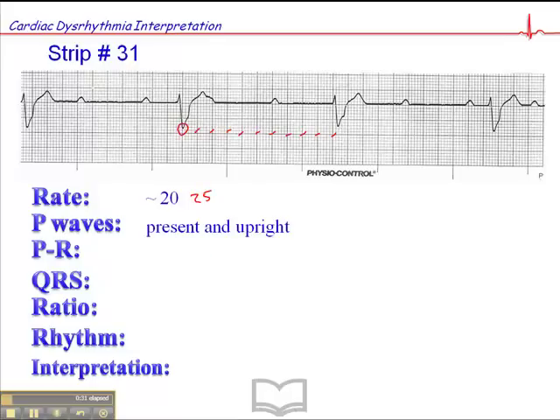We see P waves — they're present, upright, and contoured — but there is no consistent PR interval, which makes us think: is there AV dissociation here? And if there's AV dissociation, is this a third degree AV block?